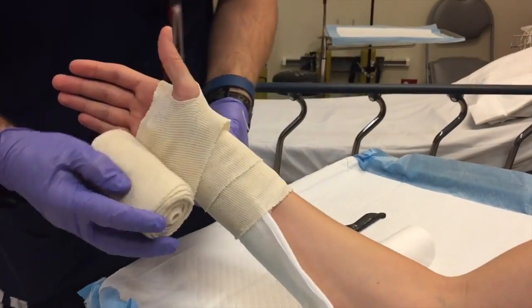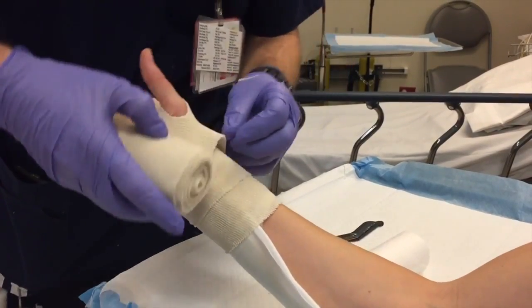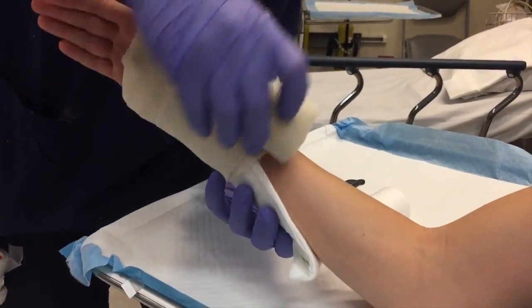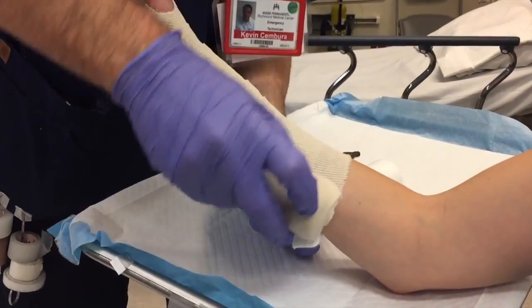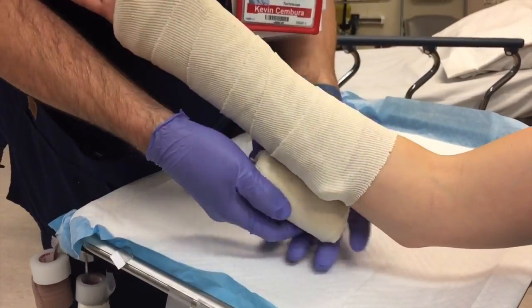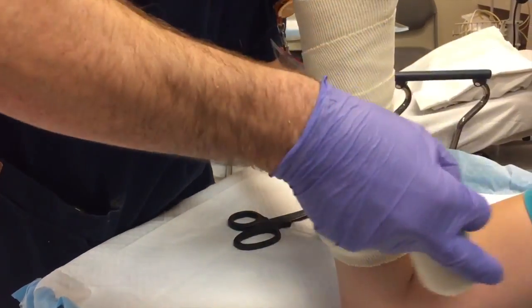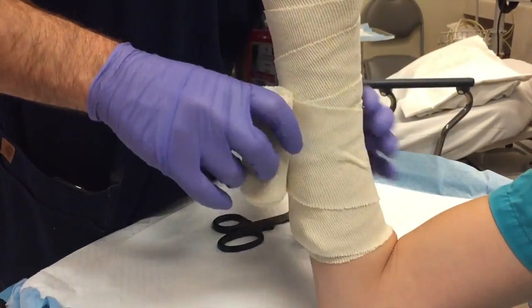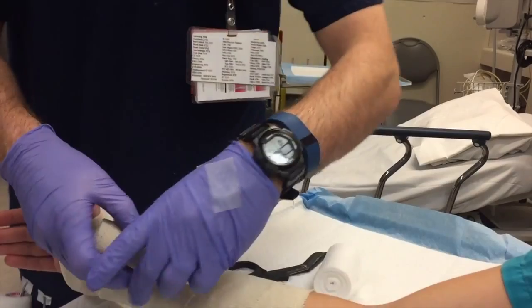That's a nice technique there, for presentation, basically. Same thing as before, a nurse or doctor would also assess for color, motor, sensory, and cap refill prior to splint application. And at the end, Kevin's also going to demonstrate what they're checking for afterwards: numbness, tingling, and making sure we have proper circulation after splint application.